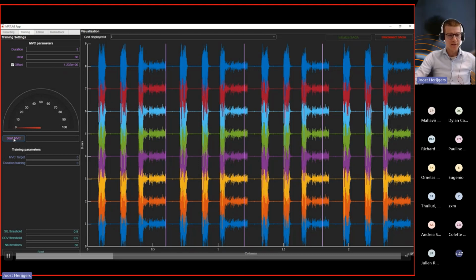So you can see that the button is being clicked and then the lever starts moving a bit. At this point, there's a resting state going on. And then as soon as the button turns green, the subject should push as hard as possible, or pull as hard as possible in this case. And then after completing that, he should return to the fully resting state, which again was a bit challenging, which is why you see the lever hanging around 3 right now.